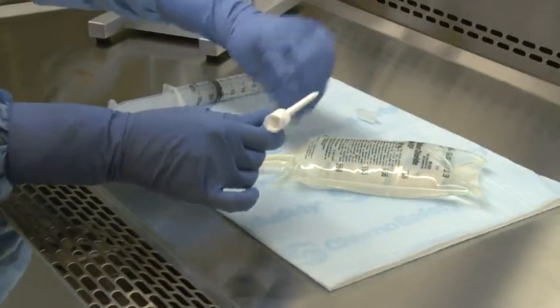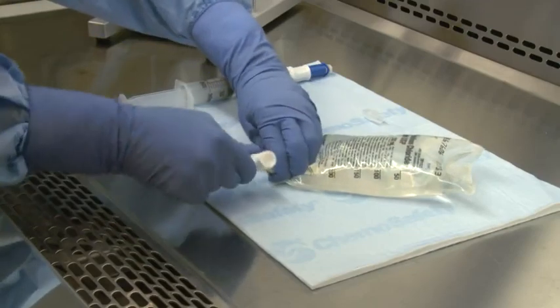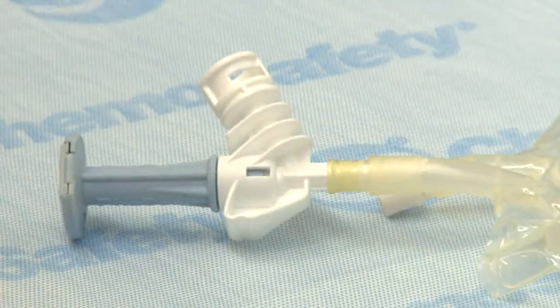On a flat surface, spike the IV bag with the BD-Facil infusion adapter. Ensure the spike of the infusion adapter is fully inserted by confirming the port of the IV bag is up and over the shoulder of the infusion adapter.